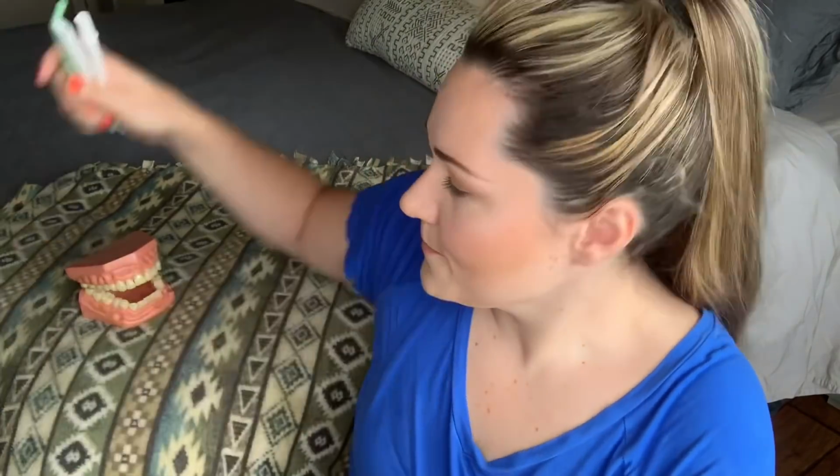I did see some comments of people saying that they suck up the tongue or the cheek, which is very common. Don't worry about that. It happens all the time. I still do it to this day. And a lot of the times it's not the assistant's fault, it's just the patient. The patient might have a crazy tongue, or as you get older, the older the patient, the looser the tissue is inside the mouth. So their cheek tissue is really loose, their gum tissue, things like that. So it's easy to suck it up. So don't worry about that.